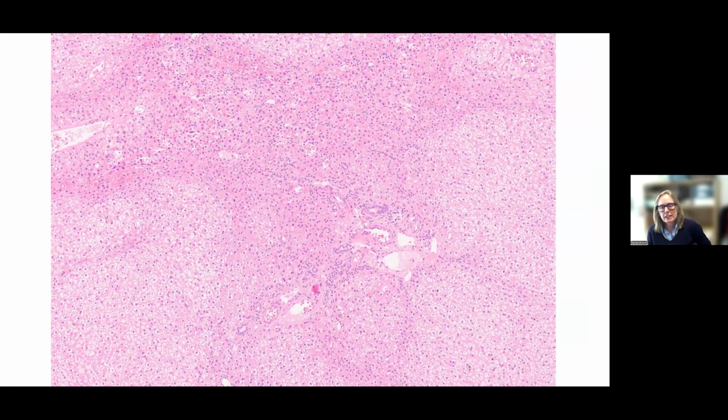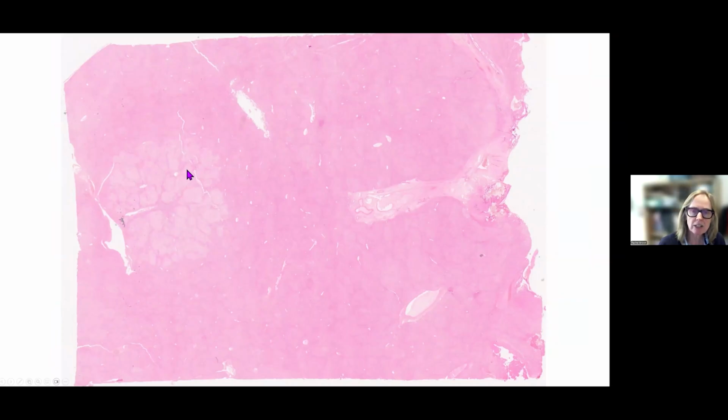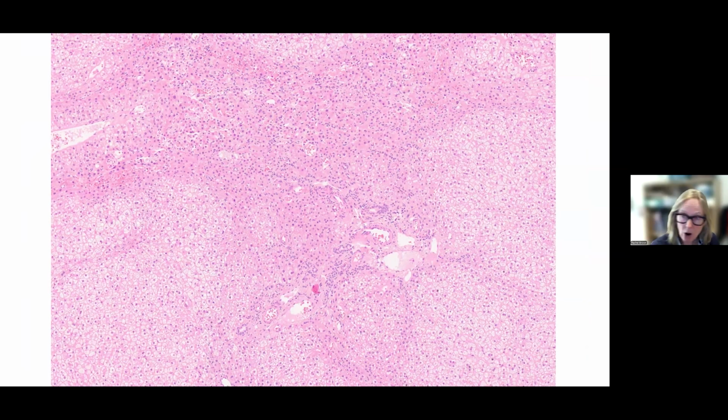Let's have a look then at the lesion itself. In that low power image, I think you could appreciate that there are some paler areas and some more eosinophilic areas. So we are within that mass-forming area in this section, but we've got a paler area and a more eosinophilic area. And it's tricky because in this region, I mentioned to you the unaccompanied arteries, and once you have your eye in for them, there are loads actually in this section. So I'm just pointing out a few here. There's another one here. So, unaccompanied arteries.